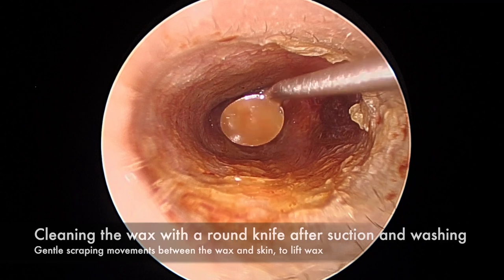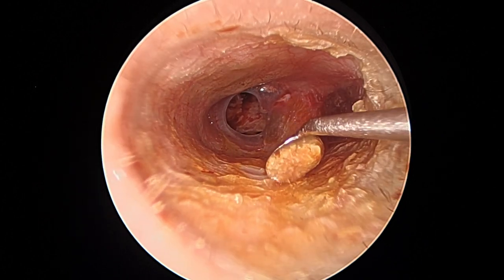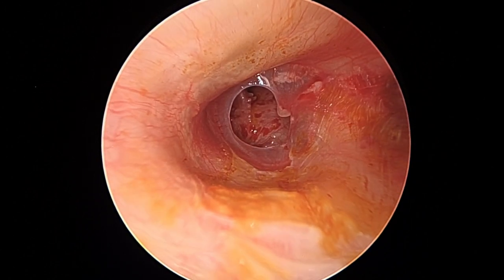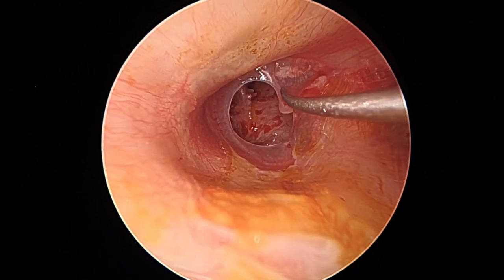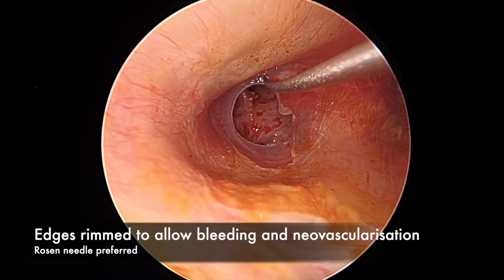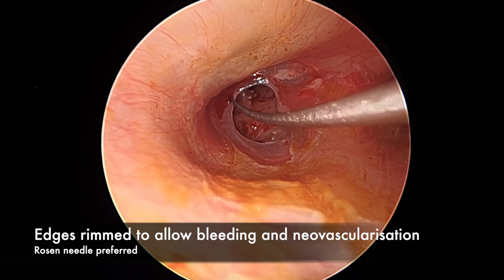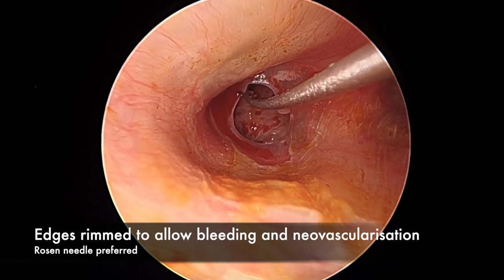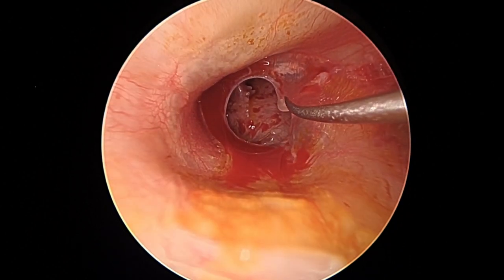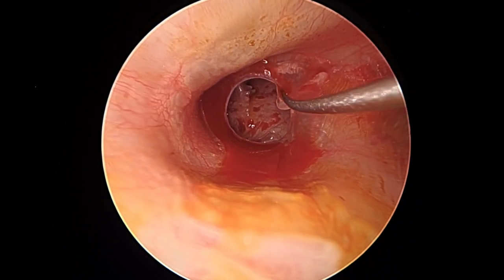The ear canal is now prepared — you can see small blebs superiorly from the injection. Using a round knife gently over the skin to clean the wax, then we suction the middle ear. The case begins with a rosen needle, rimming the perforation to allow bleeding and subsequent revascularization. We begin with postage stamping, then tearing along the perforation down to the inferior aspect. Care must be taken near the umbo as it's quite a delicate area.